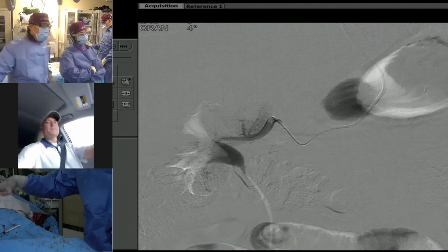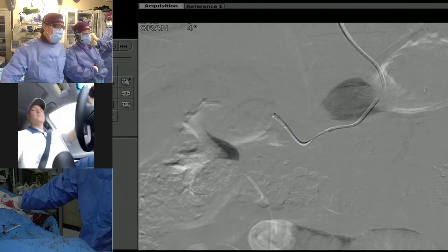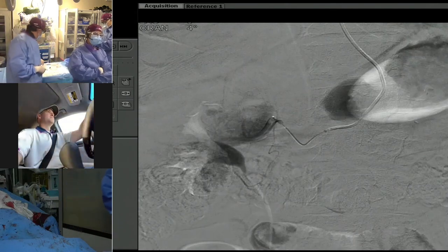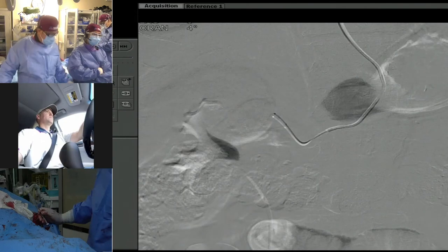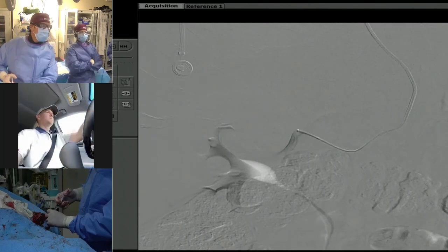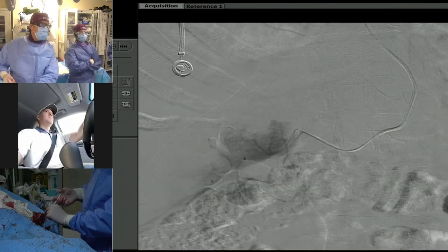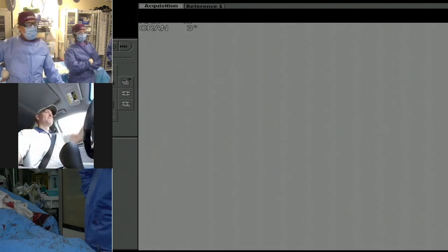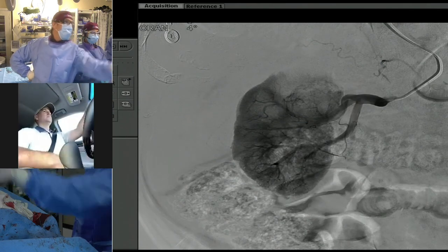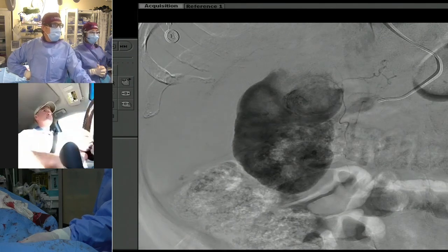So we have an interesting artery here, because it looks like the proximal branches supply the tumor, but the distal branches don't. Do we think that is tumor, or it's just not that hypervascular? We're going to do a different oblique. I'm not sold on that. That looks like normal parenchyma to me. Would you guys agree? Yeah. You can see that there are definitely tumor vessels off of this distal branch up here, right? You can see a roundness to it. I wonder if it's the other branch. Yeah, that's the next one.